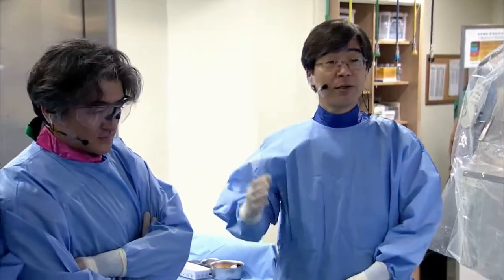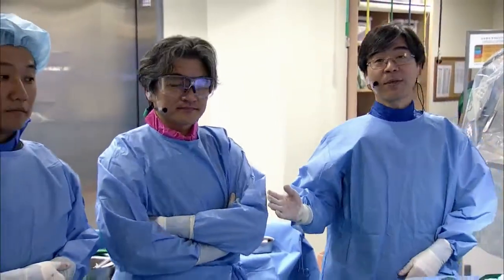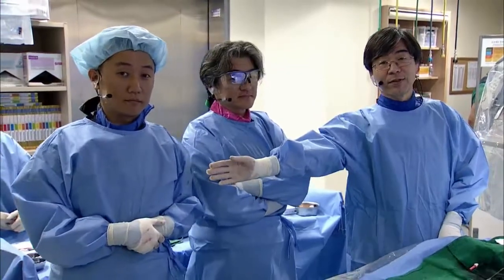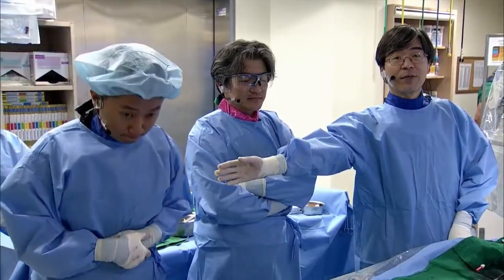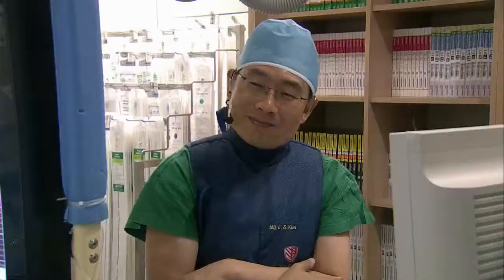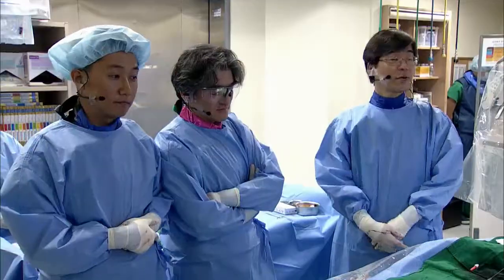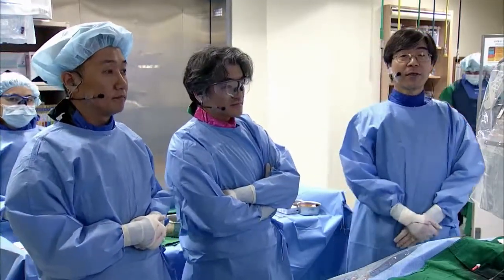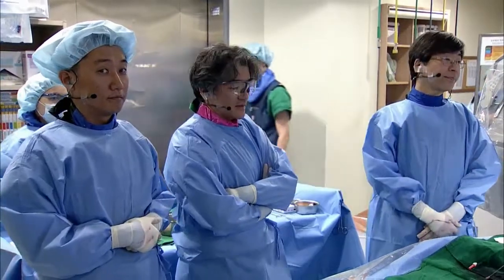Before starting the procedure, let me introduce my team. On the right side, Professor Byung-gu Kim, assistant professor Seo from the Myeongja Hospital, and the imaging reading was done by Jung-sun Kim. First of all, Professor Kim will introduce the patient case.